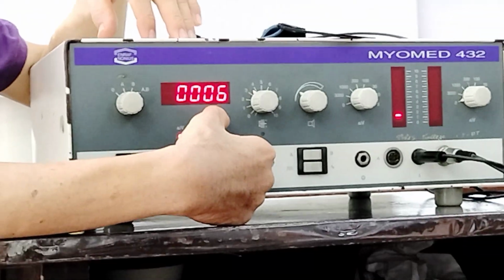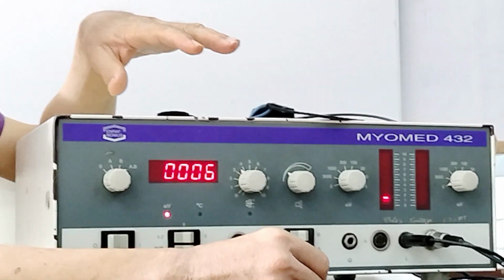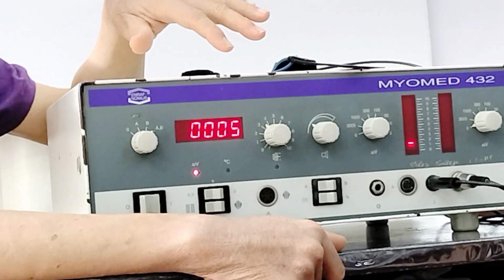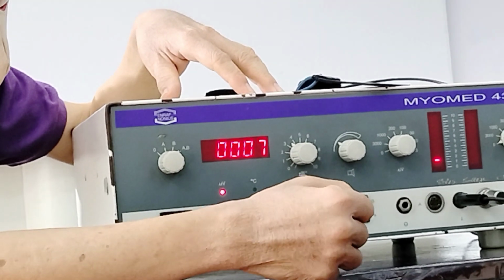But if channel B is greater, let's say channel B is 12 and channel A is 7 microvolts, 5 will also appear, but with the horizontal bar here. Okay.